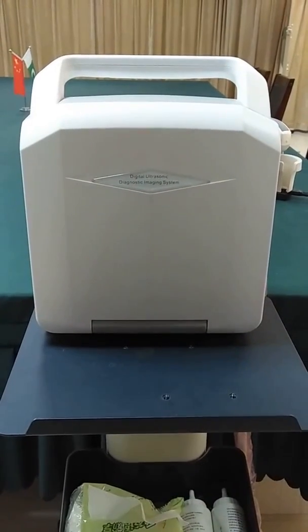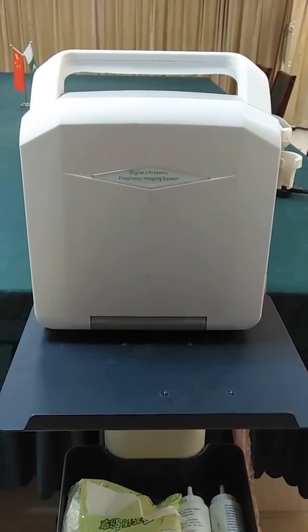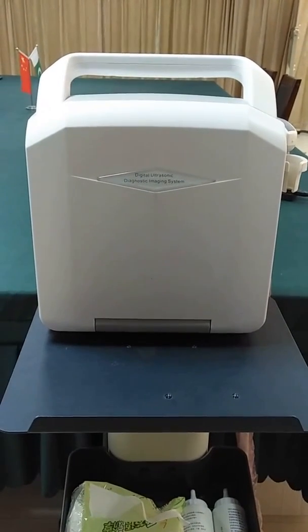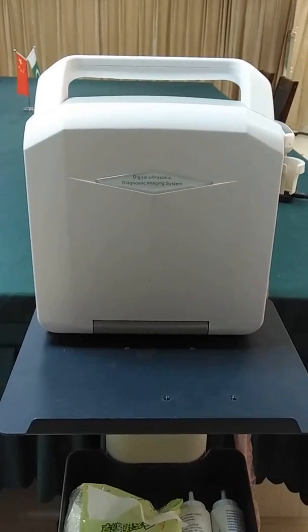Hello everyone. Here comes the most popular black-and-white ultrasound machine: the Digital Ultrasonic Diagnostic Imaging System.